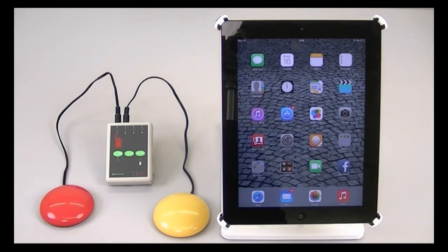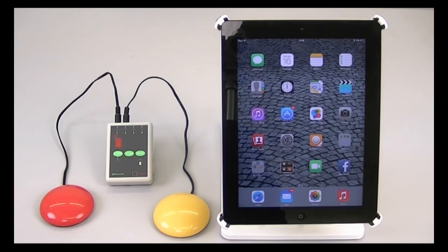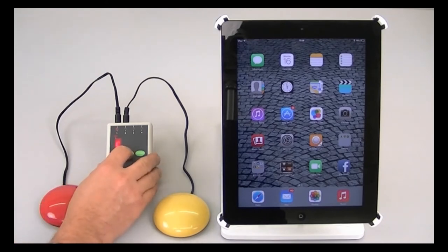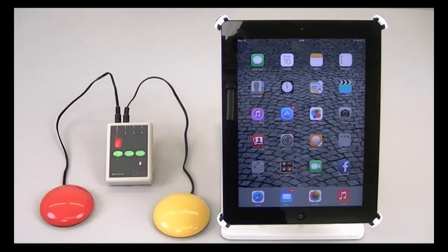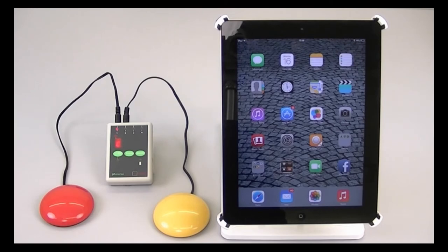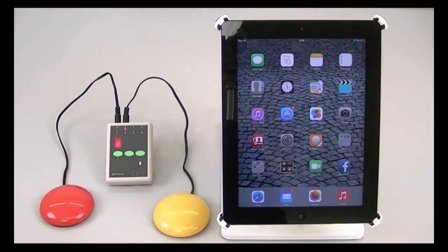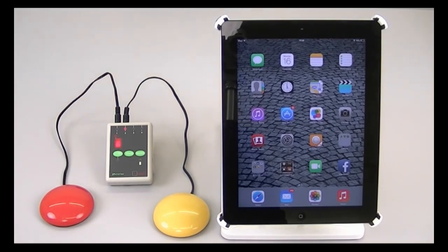In this setup I have here, the applicator is already paired to the iPad over Bluetooth. Channel one, that's the red switch, is already set to function C, which is right arrow, which we're going to use to move to the next item. And channel two is set to function six, which is enter, we're going to use that for select item in this example.